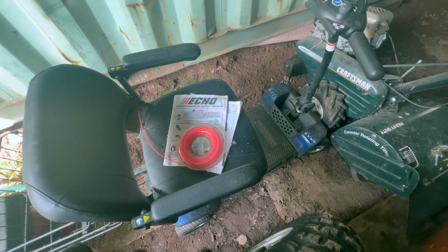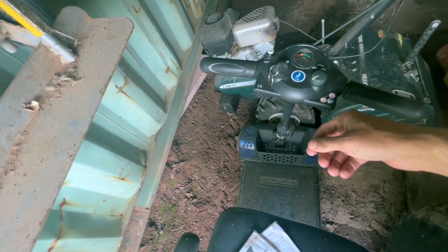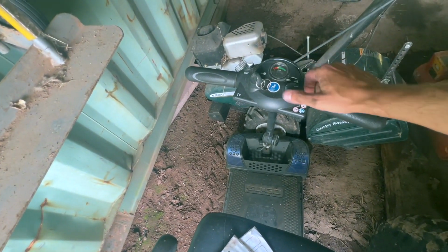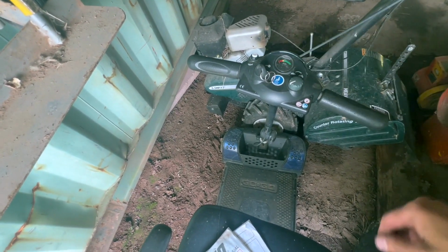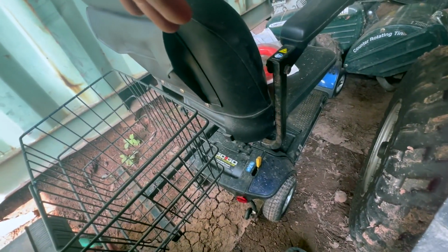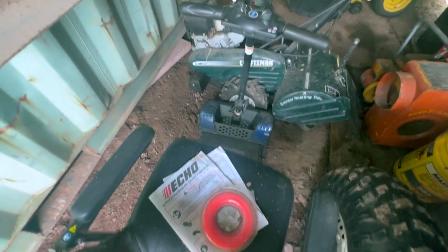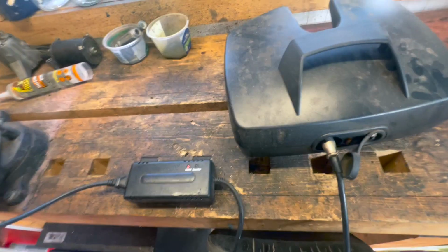From what I can tell, it's fairly straightforward. The battery pack sits here. I do have that removed for the time being, and I'll show you why. Pretty straightforward. On, off, speed control, horn, steering. There must be a DC motor, possibly two, in the rear end for the transmission. But let's go into the shed and take a look at the battery pack.